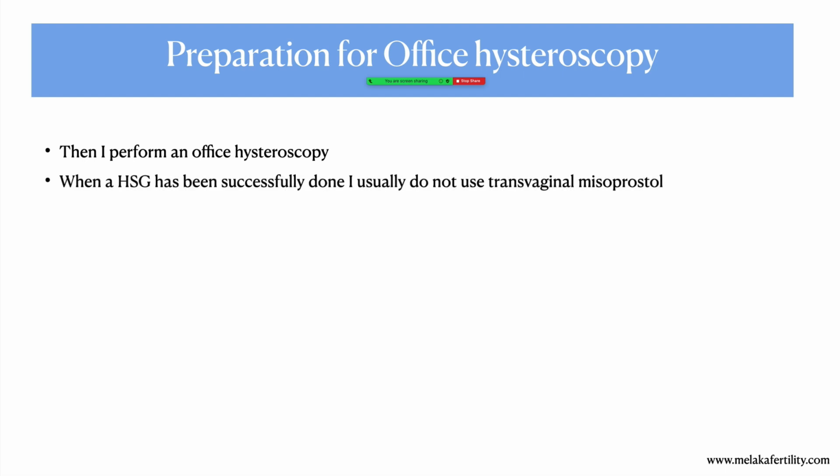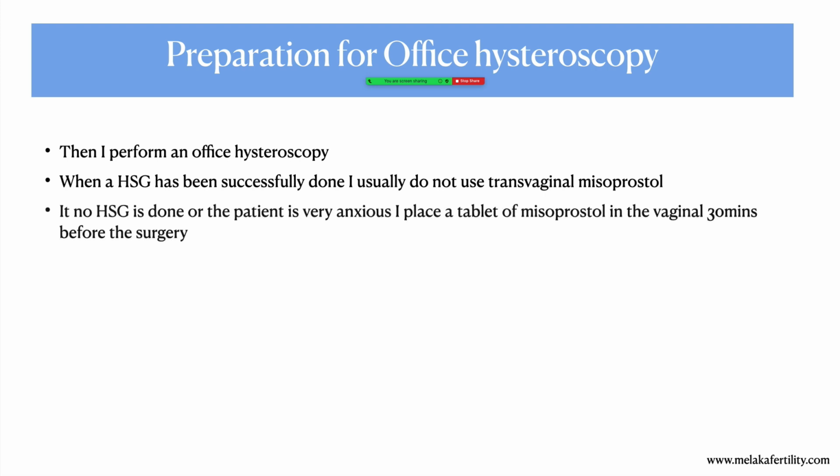No appointments on the same day. So when the HSG has been successful, I'll do the office hysteroscopy without misoprostol. But in some patients, if the HSG has not been successful or they come on another day, then I will use misoprostol, which is Cytotec. So if no HSG is done and the patient is very anxious, then I'll place a tablet of misoprostol.